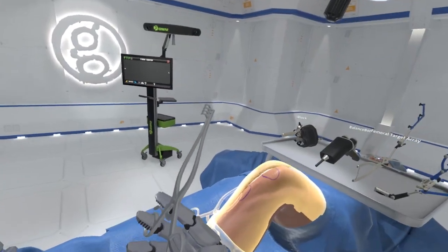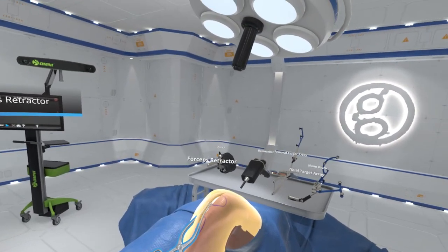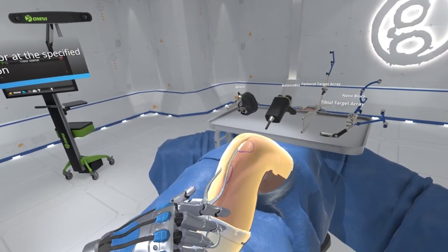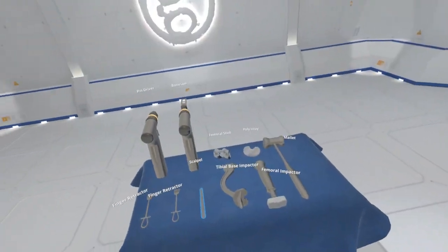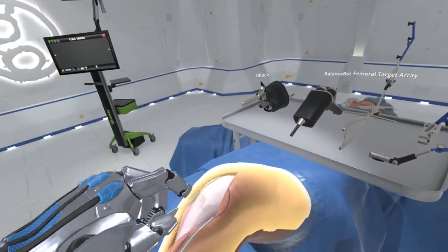When you are ready, use the retractor on the Mayo stand to expose the fascia surrounding the joint capsule. Select the scalpel from the Mayo stand. Now make an incision in the fascia. Use the highlighter to begin this incision.